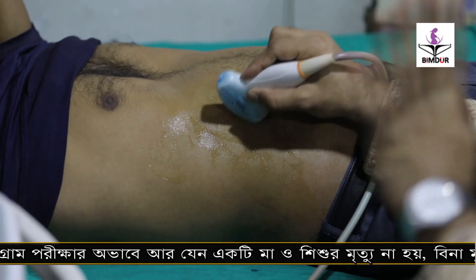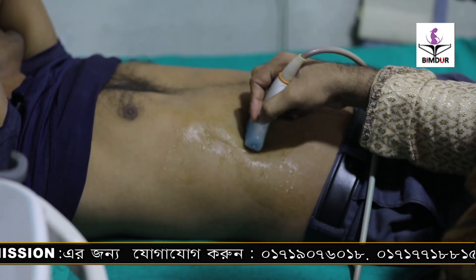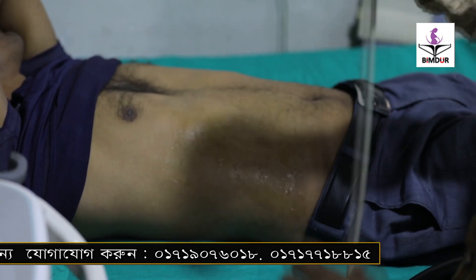This is the probe direction. When we scan the upper abdomen or whole abdomen, we place the probe and probe direction is very important. The direction is sagittal, and you will take measurements sagittally — anterior-posterior — and also transversely.